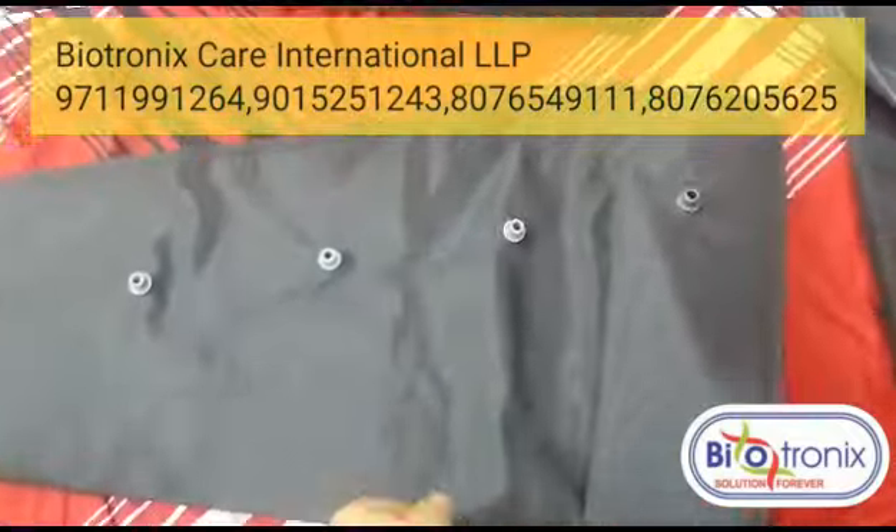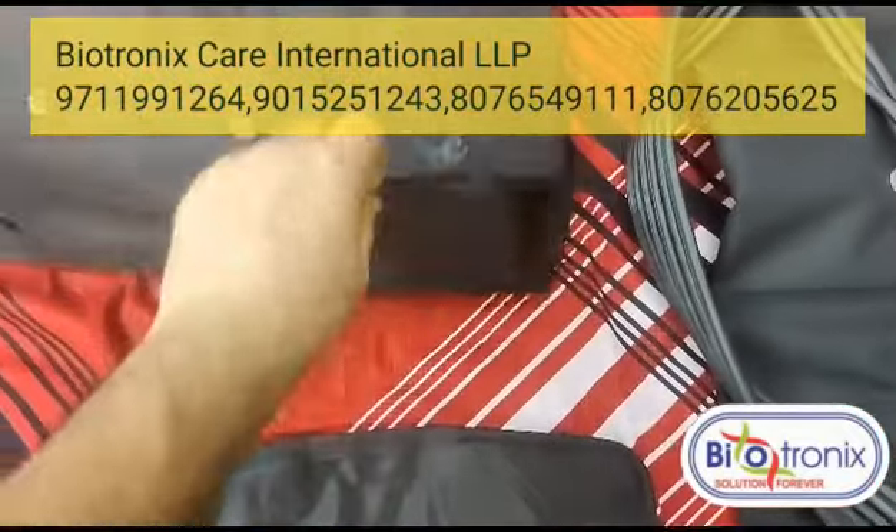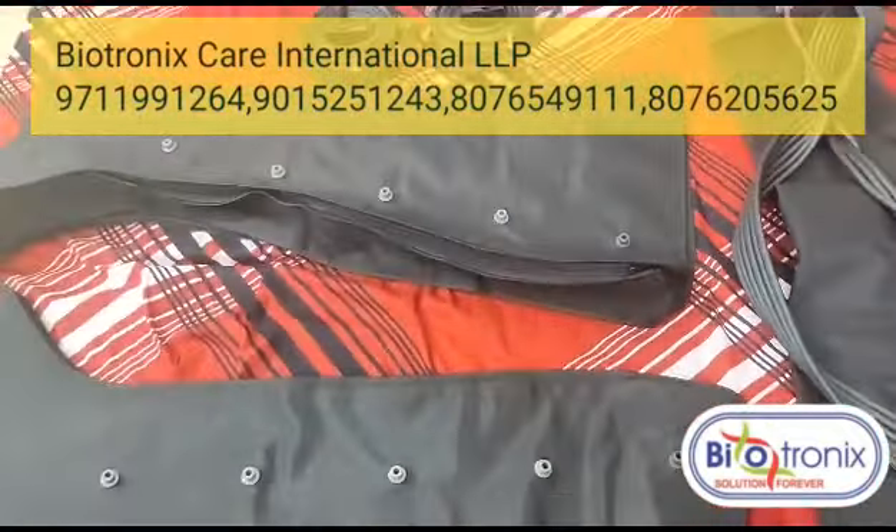Without the extension, the size is standard, but once the extension is added, the size increases to accommodate bigger legs.